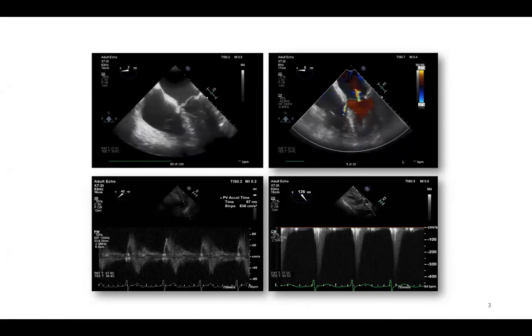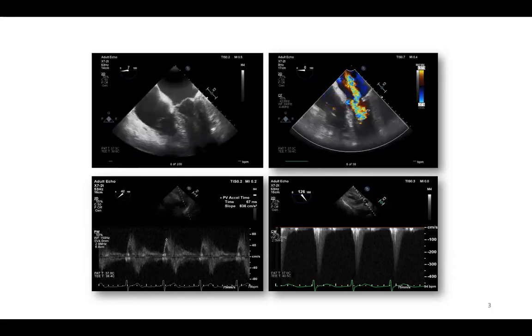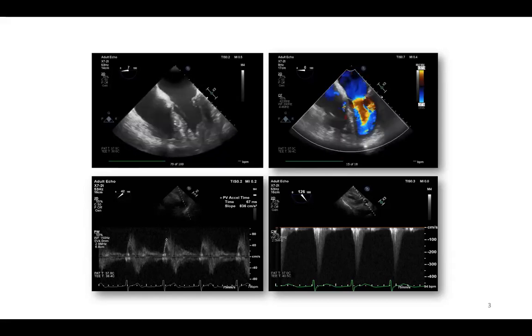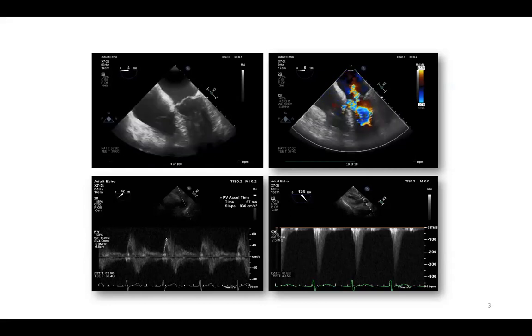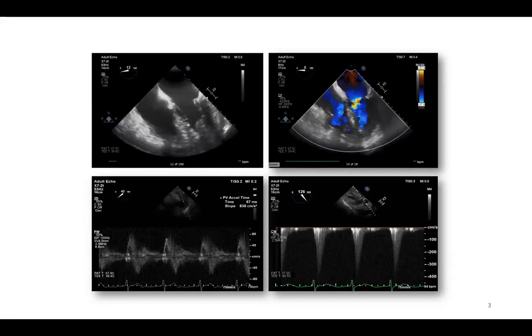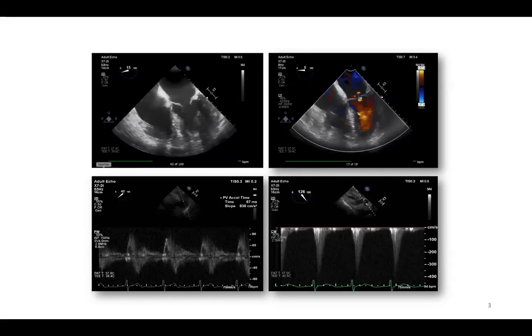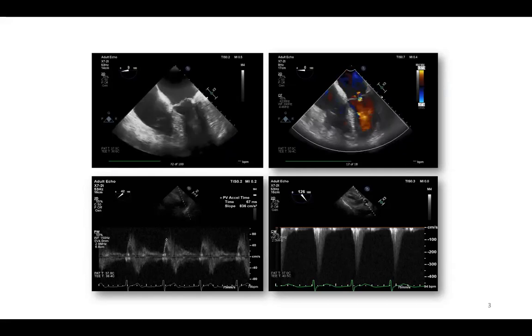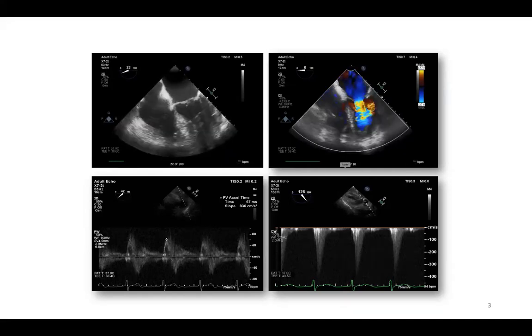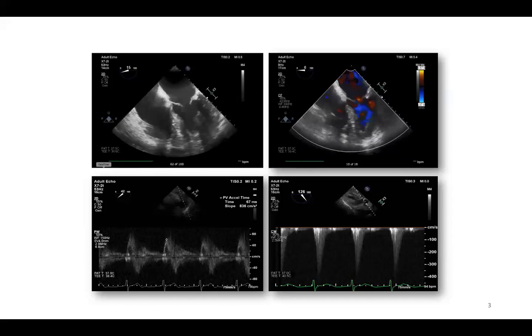And when we looked with continuous wave Doppler at the level of the left ventricular outflow tract, you can see a significant acceleration across this LVOT. And you can see this in the lower right panel with a high velocity, exceeding 4 meters per second. And when we also looked into the right ventricular outflow tract with transesophageal echo at the upper esophageal level, you can notice that the acceleration time across the pulmonary artery was shortened. And this would indicate an increase in the pulmonary vascular resistance in this patient. So what is clear here is high acceleration across the LVOT, hyperdynamic LV, RV impairment, and increased pulmonary vascular resistance.